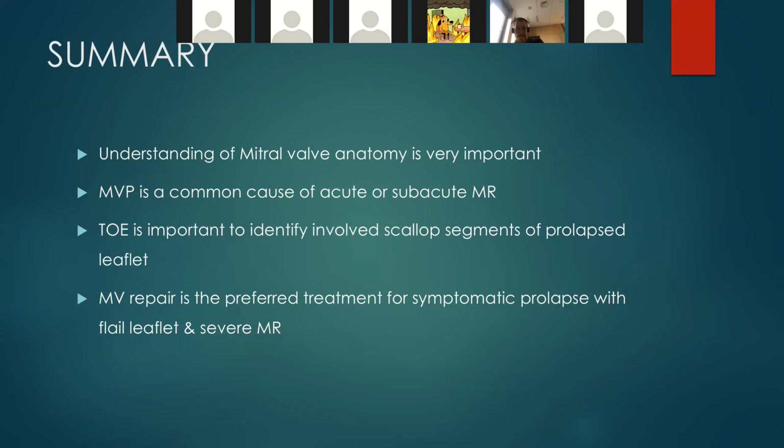In answer to your question, yes, we do have the 3D TOE probe in the cardiology lab, but for the DDU side of things and for advanced echo education, the argument is that you should be able to get it on 2D without 3D. Learning it from 2D is really important to then move on to 3D, because we should be able to do both. The 3D shouldn't add too much more to what you get on 2D, which is why we focus mainly on 2D for some of the teaching. Yep, that's understandable. Thank you, guys.